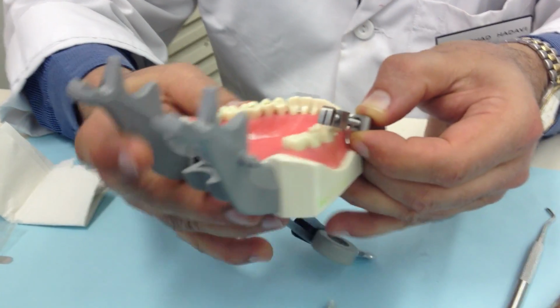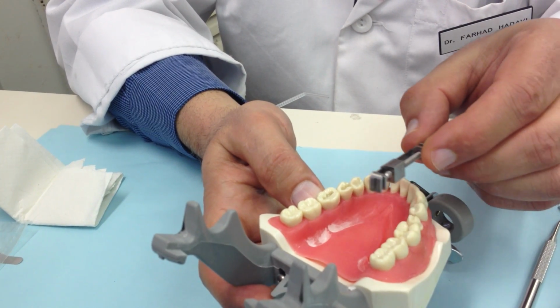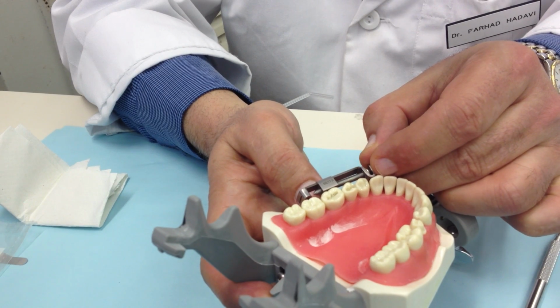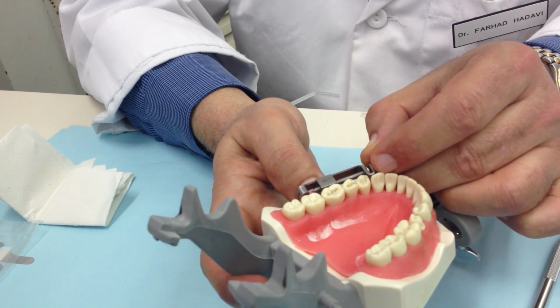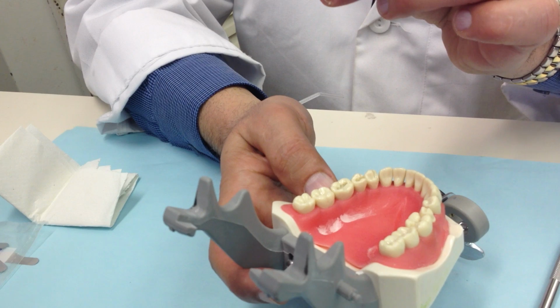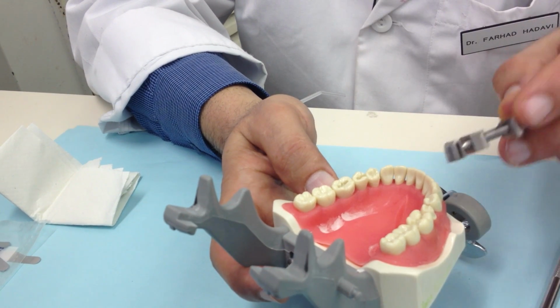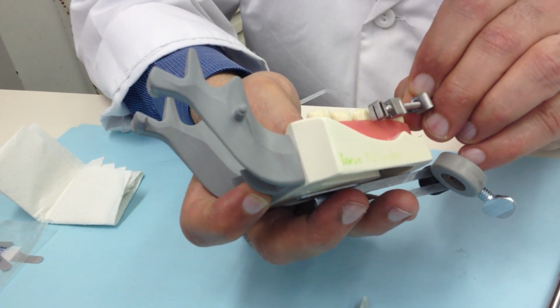Now, if I go to the other side, you can see the plunger side comes toward the surface, correct? So the rules, now you know: in the upper right and lower left, the plunger side. On the upper left and lower right, the flat side. You can see now the open side.